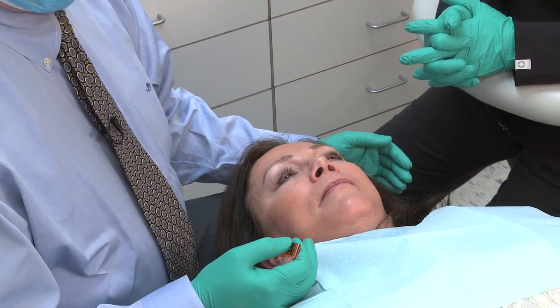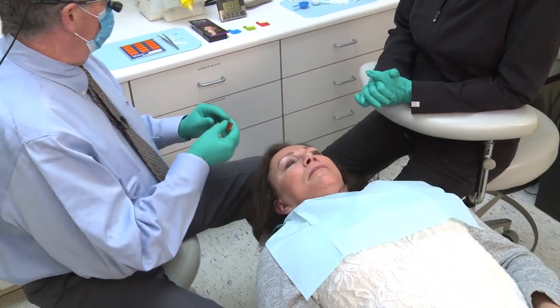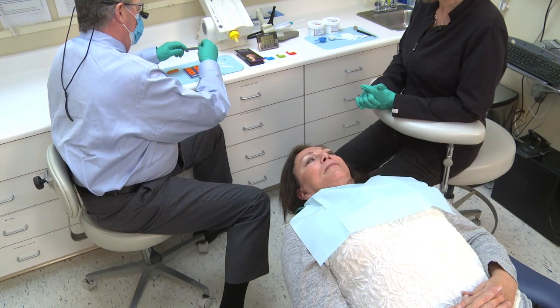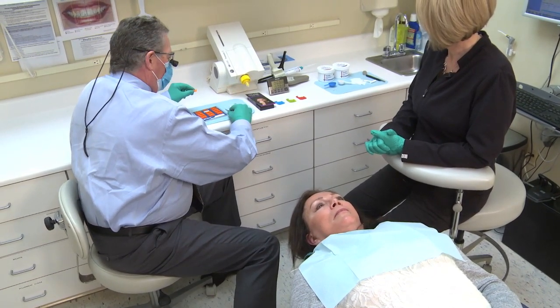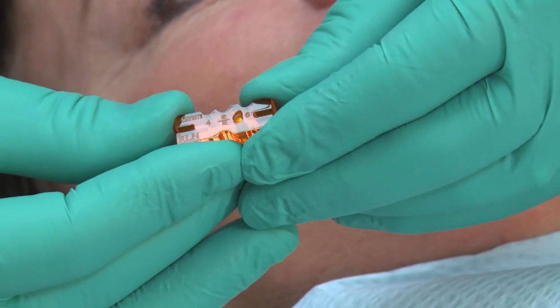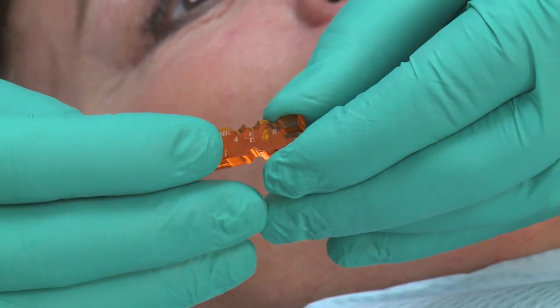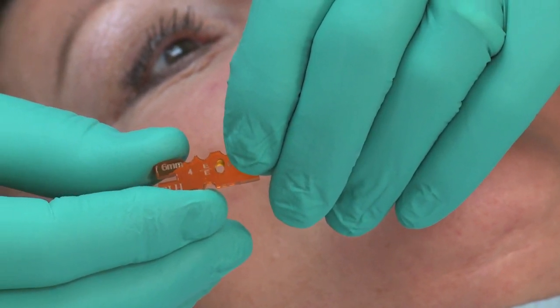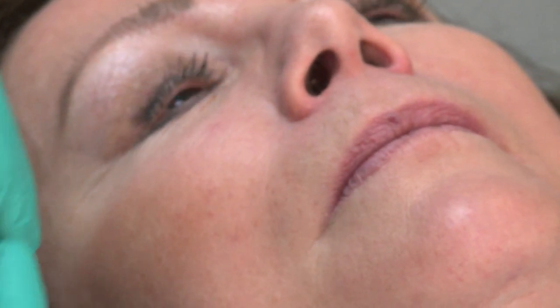So let's try and figure out our exact position. We now know that 8 millimeters of vertical is better than 4. Let's go to our Airway Metrics kit, and let's start at 6 millimeters of vertical. So that would be the middle row key. This is the 6 millimeter vertical key. And as you can see on here, we have edge to edge in the center, E over E, 4 millimeters of horizontal or 6 millimeters of horizontal. So I always like to go less is more, meaning I can always go edge to edge and all the appliances advance forward. So let's see what 6 millimeters of edge to edge sounds like.